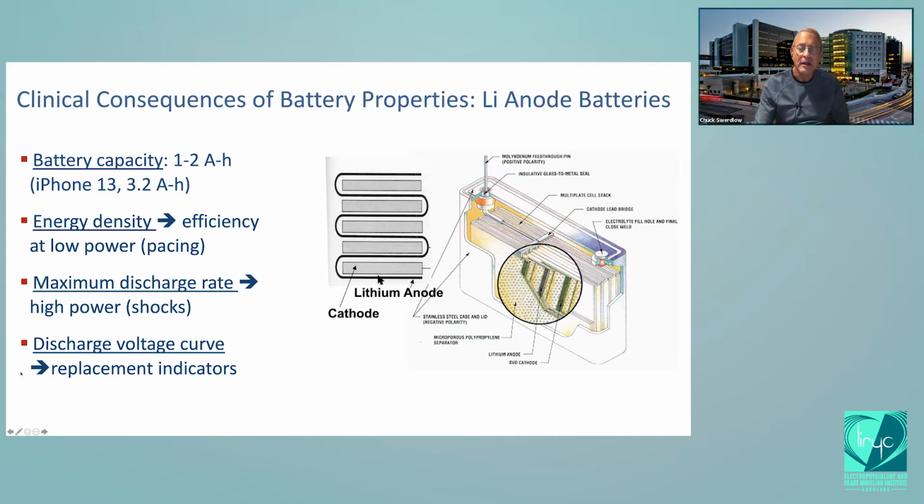On the other hand, if the physical properties of the cathode change as chemical reactions occur, crystals form, and it puts a little force on the separator. If you puncture that separator, the battery's dead. So battery design is a complicated art.